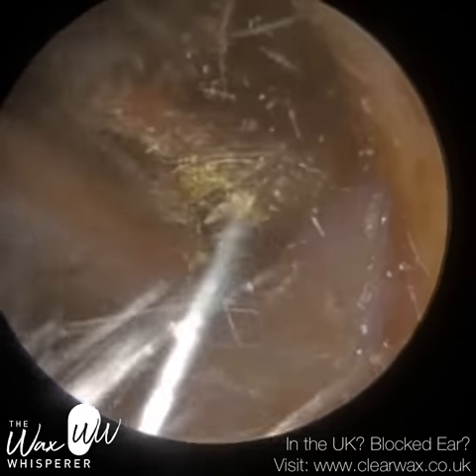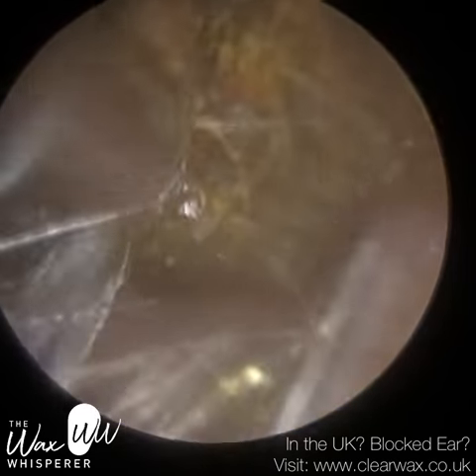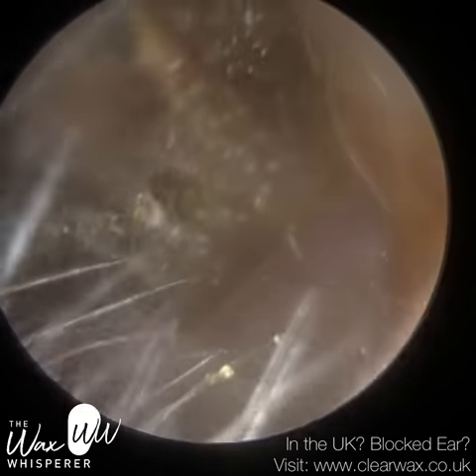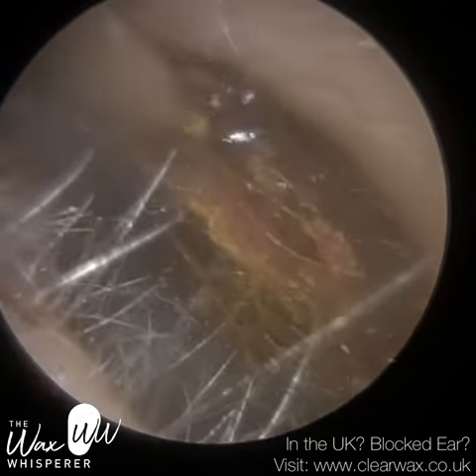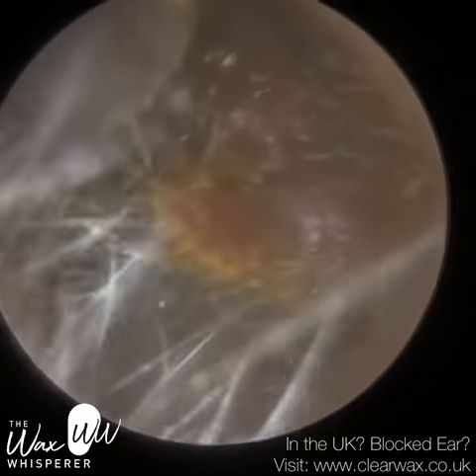You may see at the bottom — I've just detached that from the floor of the ear canal. And I'm just working at the back part here to loosen it from the posterior canal wall, and I'm giving it a little wriggle. Whilst I was doing this, the patient reported it to be slightly uncomfortable on a couple of occasions.